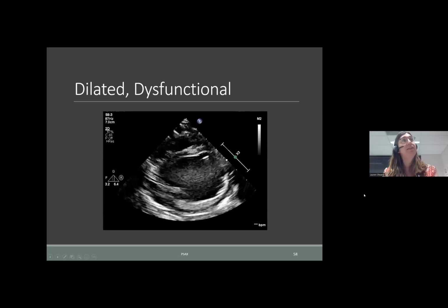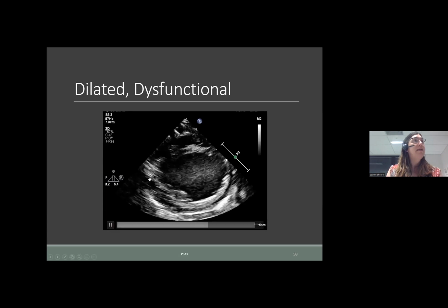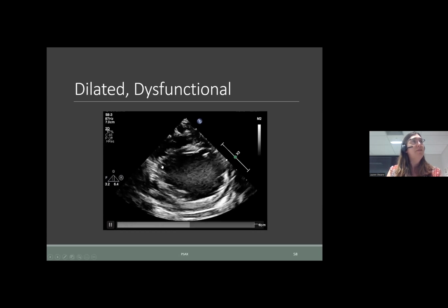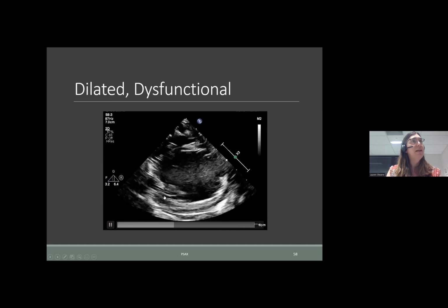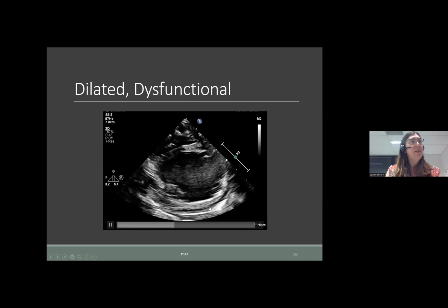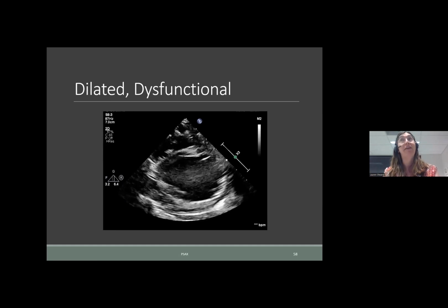And this is the short axis view. And again, this is a cross-sectional view. We're seeing the left ventricle here in cross-section, and it's nice and circular. And again, similar to that last view, the septum, the middle muscle of that left ventricle, is still doing something. But as we look more laterally and inferiorly, we see that this is a thin muscle that doesn't squeeze particularly well. In fact, it squeezes very, very poorly.